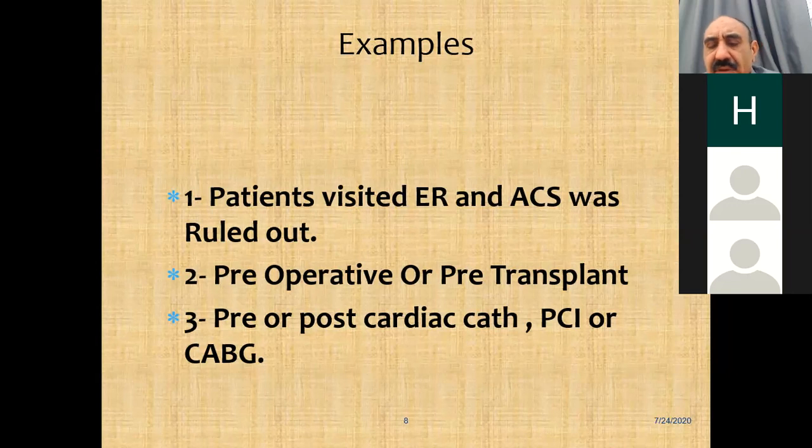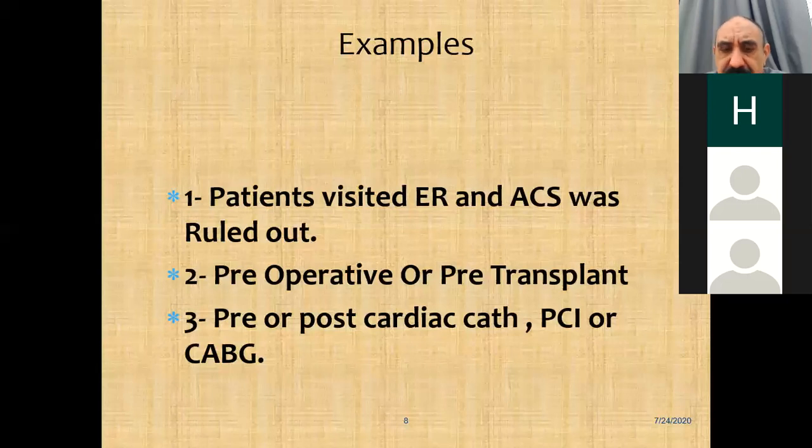The third category of patients sent to the nuclear cardiology lab are patients who went to the cath lab, and the doctor in the cath lab found a borderline lesion that he wanted a physiological assessment of. He found, for example, a 60 to 70% LAD lesion, and he would like to see if there is inducible ischemia by nuclear cardiology.